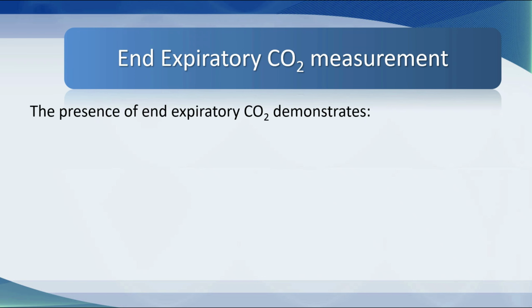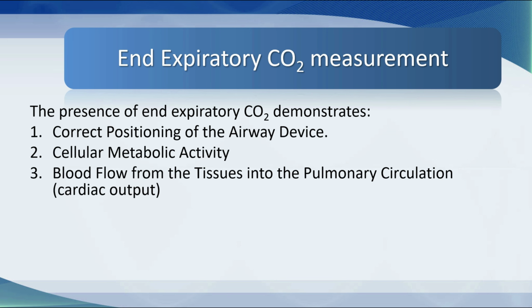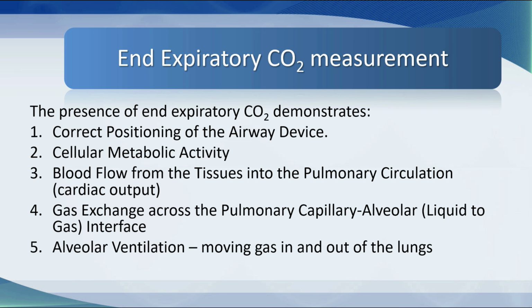So the presence of end expiratory CO2 demonstrates correct positioning of the airway device, cellular metabolic activity, blood flow from the tissues into the pulmonary circulation or cardiac output, gas exchange across the pulmonary capillary interface, that's a liquid to gas interface, alveolar ventilation, moving gas in and out of the lungs, and the diagnosis of cardiopulmonary disease.